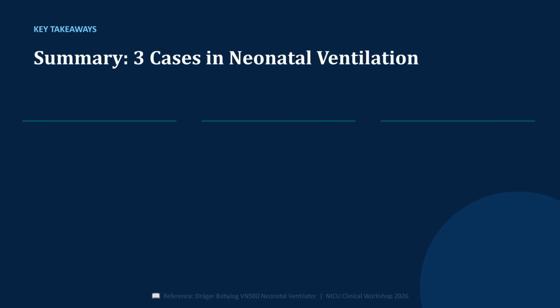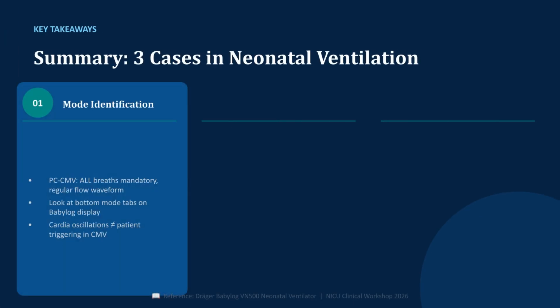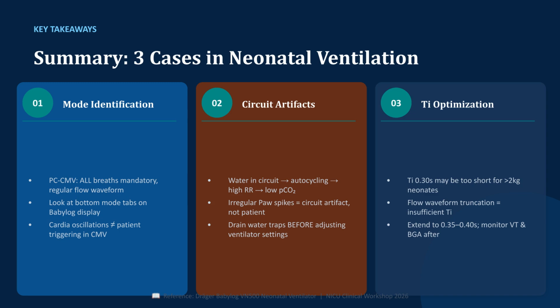In summary, we covered 3 key areas. Mode identification, emphasizing the regularity of flow waveforms in PCCMV. Circuit artifacts, recognizing that water causes high RR and low PCO2, requiring trap drainage first. Finally, TI optimization, using flow waveform visualization to ensure complete volume delivery for better recruitment.